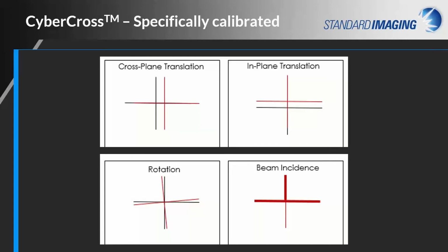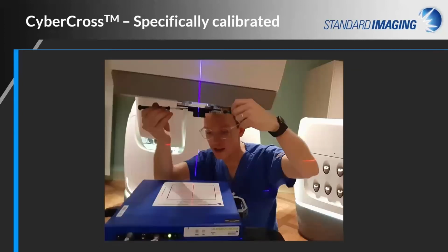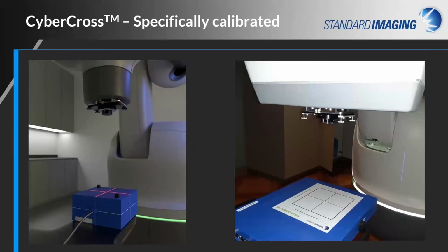These diagrams highlight the calibration steps, with the black reticle representing the calibration template and the red reticle representing the laser crosshair beam. Here, our QA StereoChecker alignment markings are being used to adjust the device crosshair shape and location. Once calibration is completed, it can be used anytime a crosshair is needed.